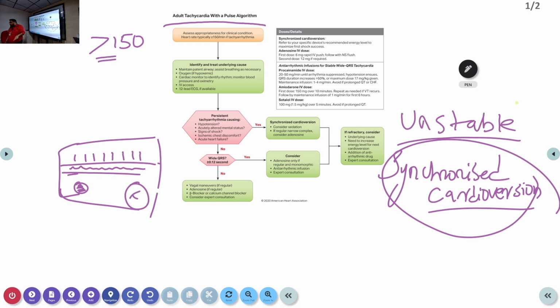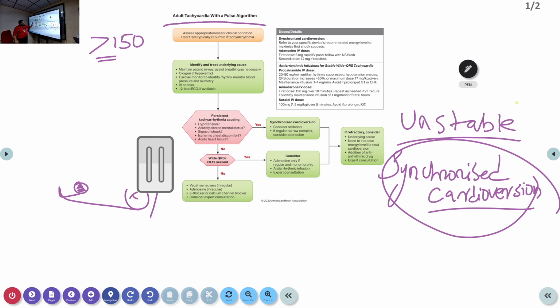Because if it is delivering the shock at any other point, the patient can go into further worsening of the arrhythmia. So during the refractory time only, at the peaking of the R wave, the machine needs to identify and deliver the shock. For that purpose, when you press the sync button, a small line will come near the R wave. You will be able to see a small line on the peak of the R wave. That is when you have to make sure that synchronization is on.